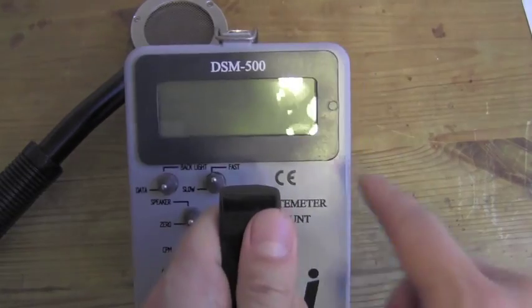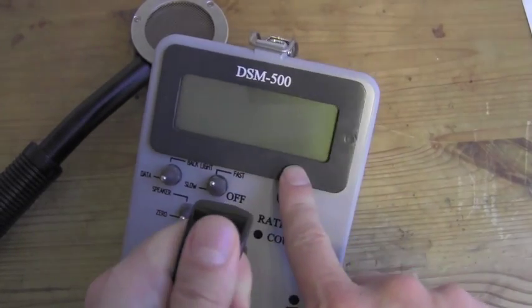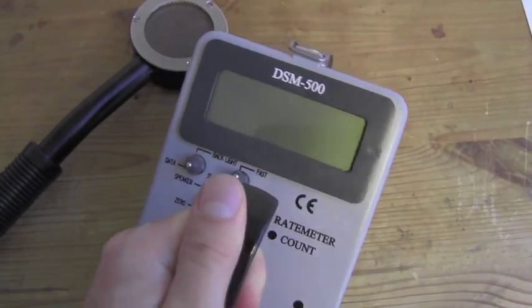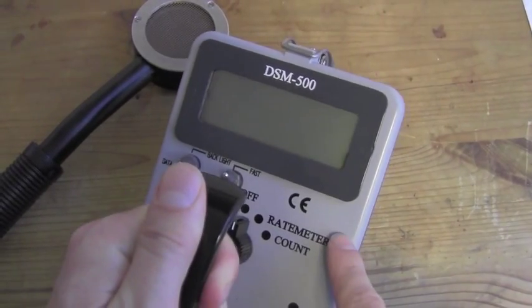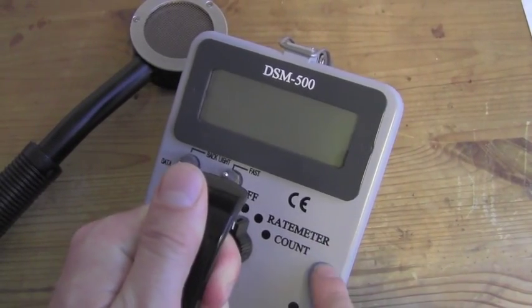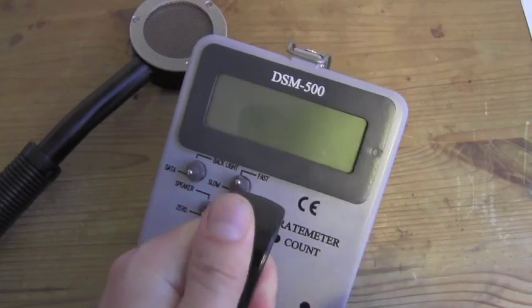It features a large backlit digital display, rate meter function, and scalar function.